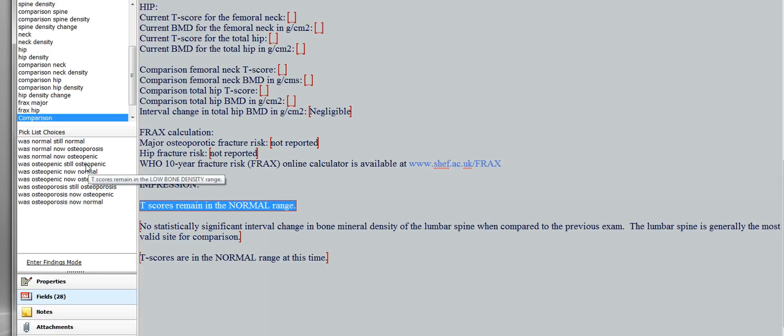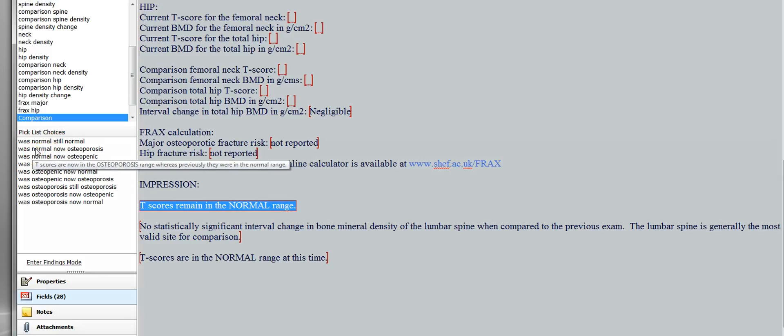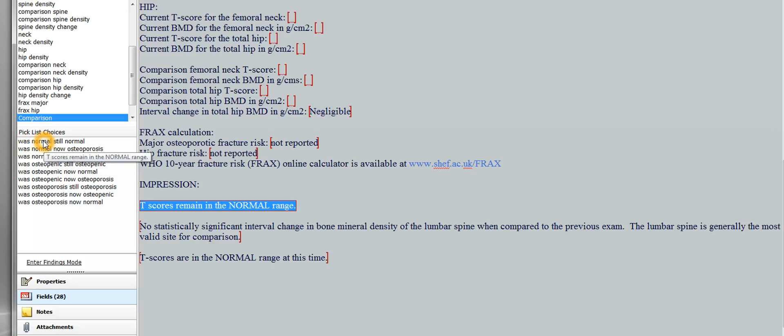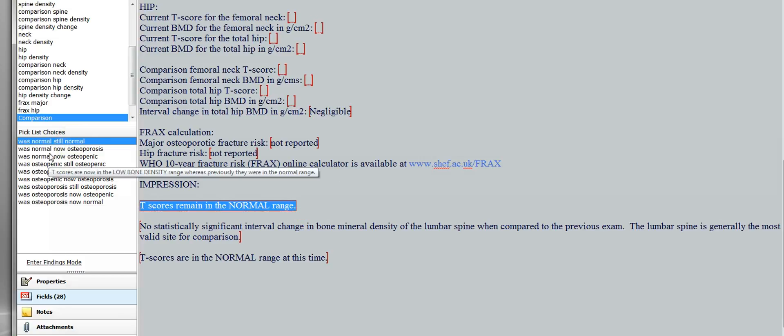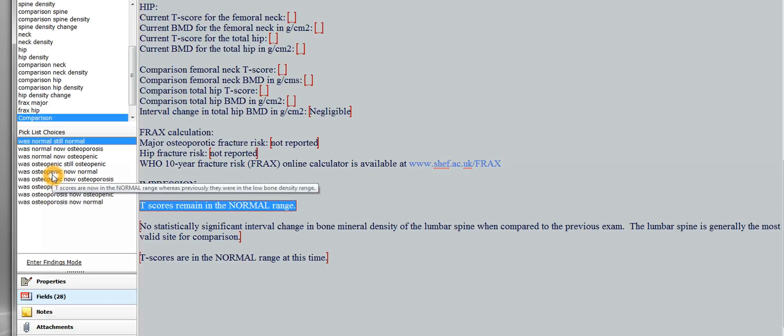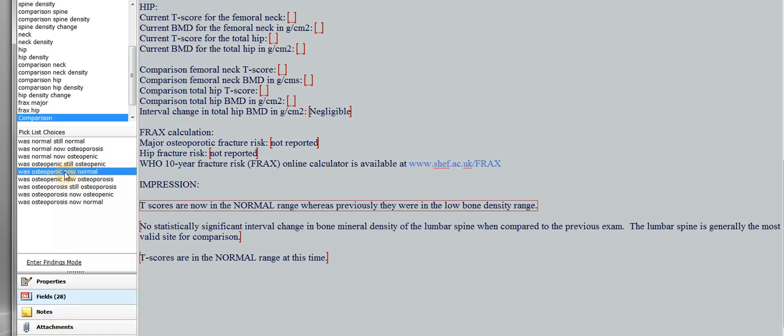So it's in here. And these have pick lists. So in simple words, this is the patient was normal in terms of WHO category, and it's still normal. So double click that one, and it'll just say T-scores remain in the normal range. Now there's every option possible here. So if the patient was osteopenic and is now normal, click that one.